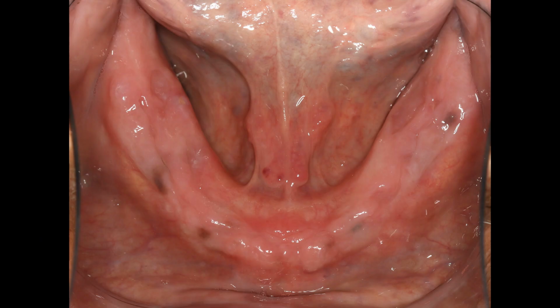This is the mirror view of the lower arch after 2 months of healing. You'll notice you don't see any implants, and that's because we cover over the implants when they're not tight in the bone, and we come back at 2 months and uncover them. This gives me a really good opportunity to improve the connective tissue or the keratinized tissue around the implants.